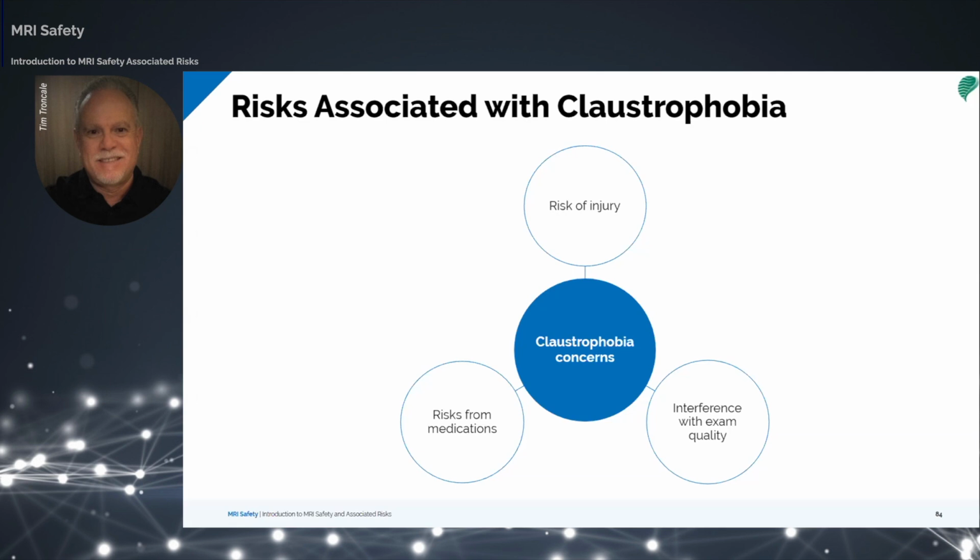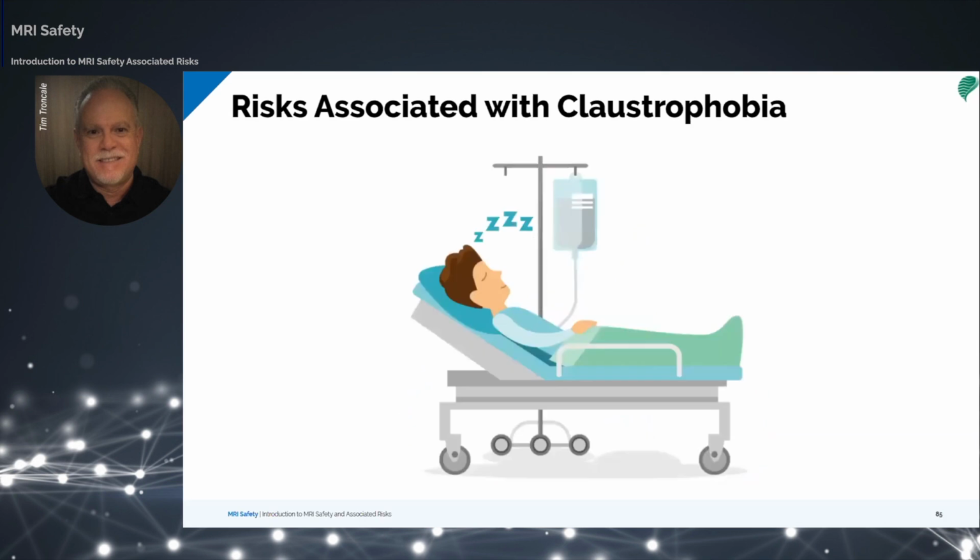Patients may move, breathe heavily, shake, or try to turn their head or adjust their body, which may impact image quality. In addition, even if medicated, patients may not follow instructions for successful completion of the study. And then we have to consider the adverse responses to medication given to sedate the patients for the duration of the MR exam. Sedation helps to eliminate the risk of injury to a patient trying to climb out of the scanner or risk of interference to the exam quality, but it can pose other risks.